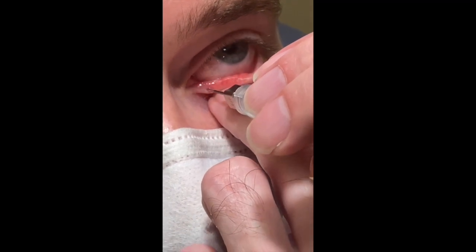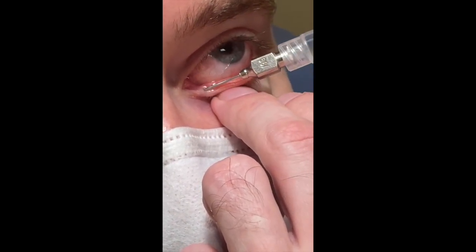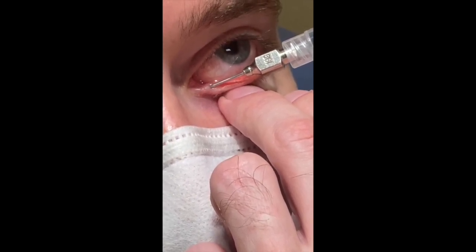This is in your foreign body kit. I go in first, turn around, and then inject. There should be no resistance to injection. Thank you.